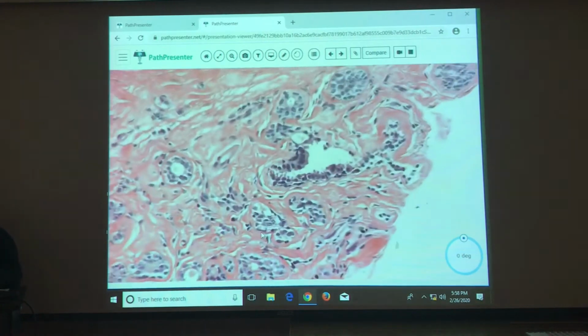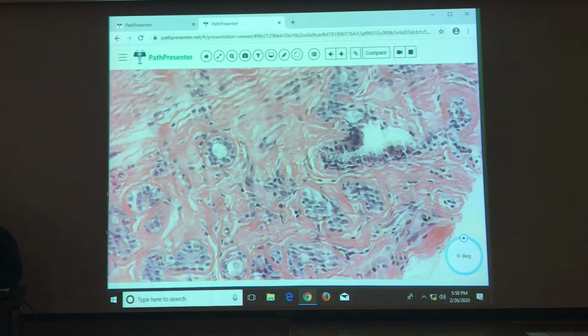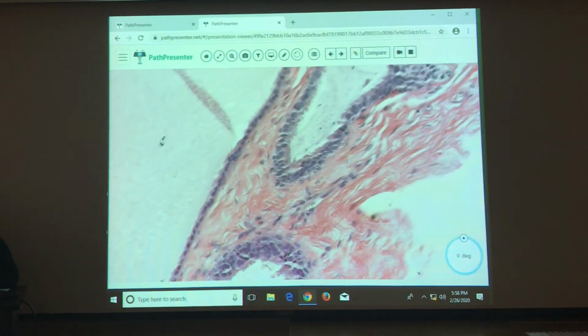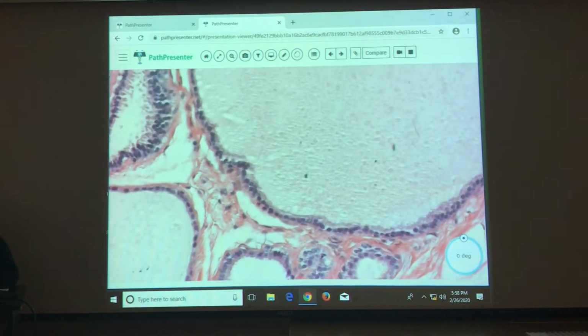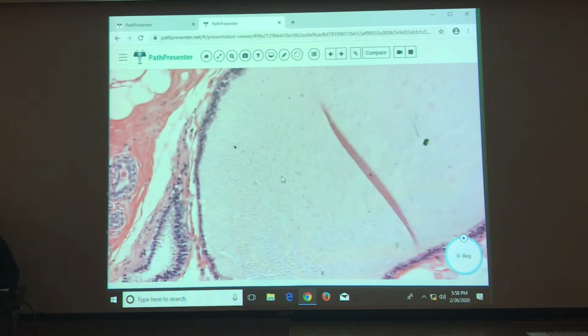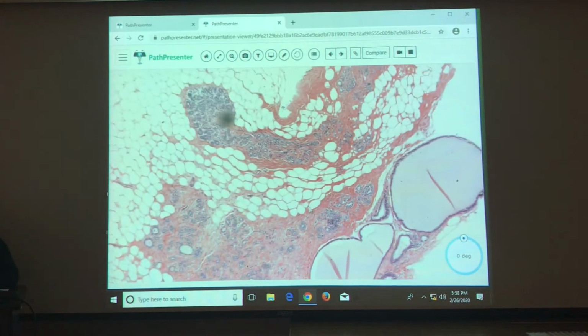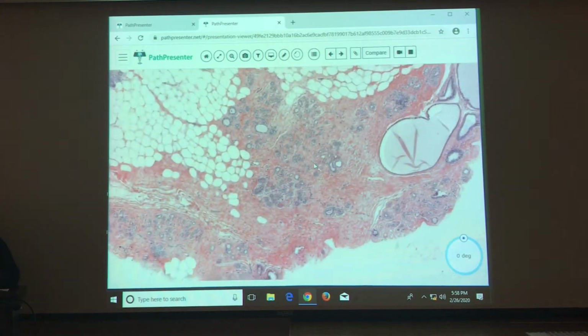What else? So we're only discussing epithelial lesions today, right? Only epithelial lesions. The only one that kind of snuck in a little bit was the gynecomastia, but it doesn't really fit in anywhere really well, and there are so many things that we want to try and cover.